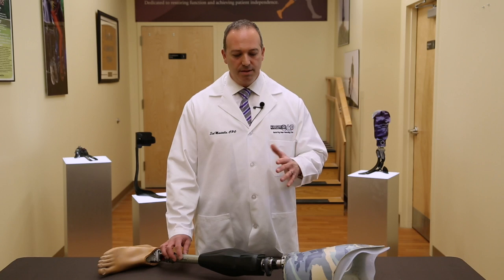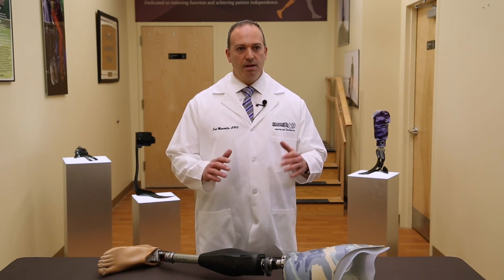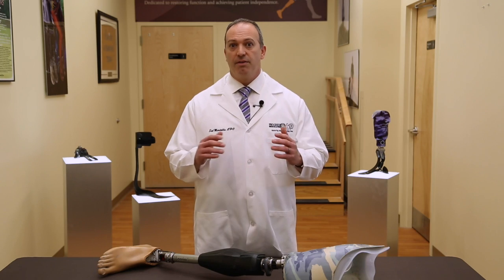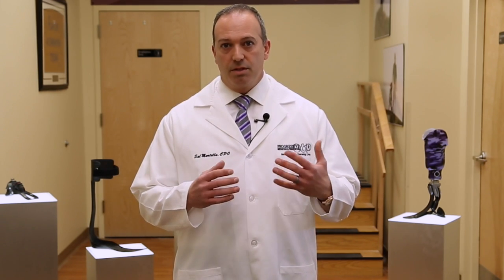The Genium is one of the most advanced microprocessor control knees in the entire world. This device offers the greatest range of stability matched with the greatest range of function. This device is virtually unmatched by any other prosthetic device out there in the world, and in my opinion, just the most stable, yet the most functional.